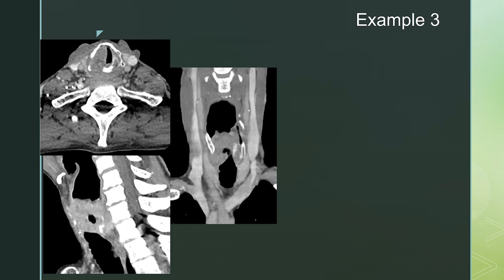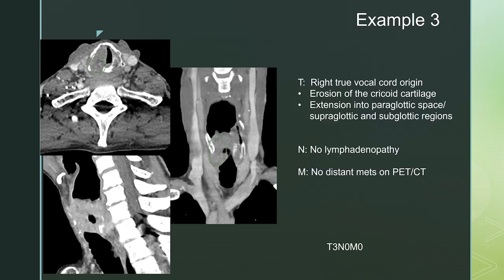Example three is a less subtle lesion. There is a right true vocal cord mass encompassing the entire right true vocal cord. The left true vocal cord appears spared, but there is erosion of the cricoid cartilage posteriorly and loss of the paraglottic fat. On the sagittal view, this is a bulky lesion extending supraglottic as well as infraglottic below the level of the cricoid. On the coronal, it almost has a U shape. This mass originates in the right true vocal cord with erosion of the cricoid cartilage, extension into the paraglottic space, supraglottic and subglottic regions, but no lymphadenopathy and no distant mets — staging as T3N0M0.